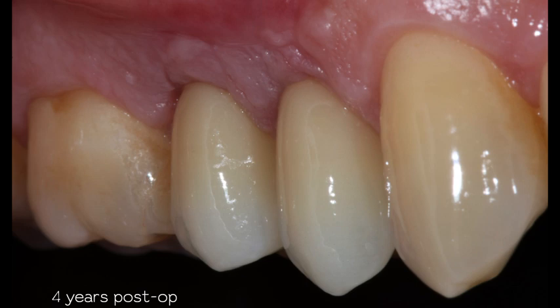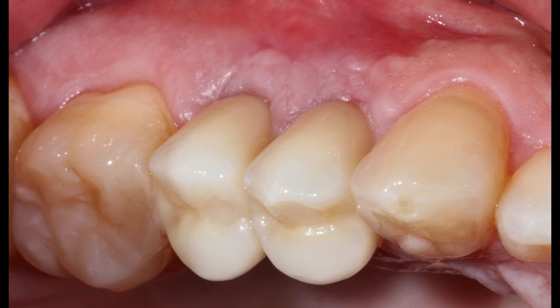I've started doing socket shield and partial extraction therapies around 11 years ago. So before that, I wouldn't be able to solve this case in this so simple and straightforward and comfortable way for my patient. And that's quite a plus, I would say.